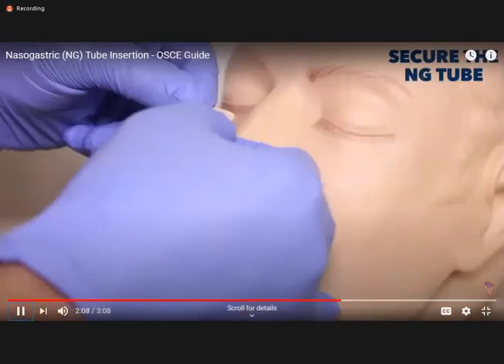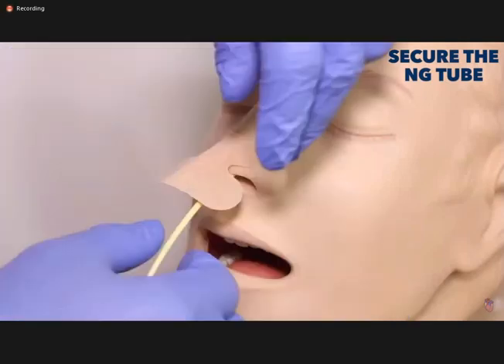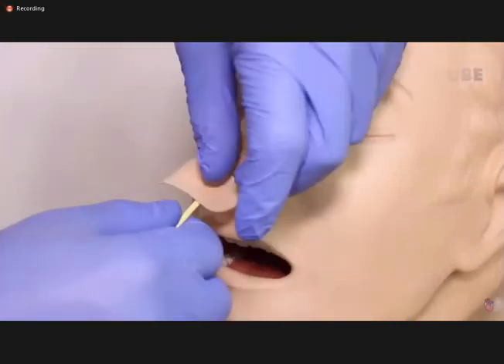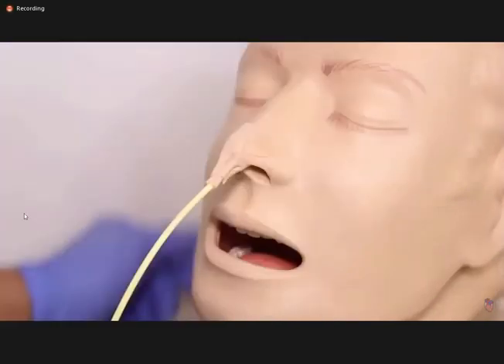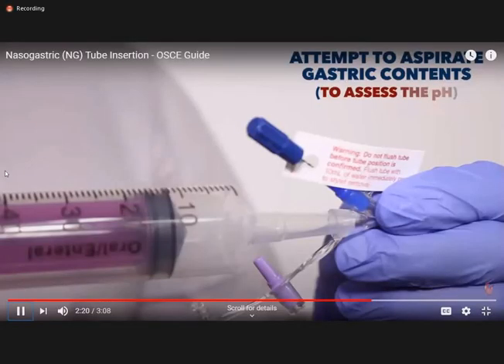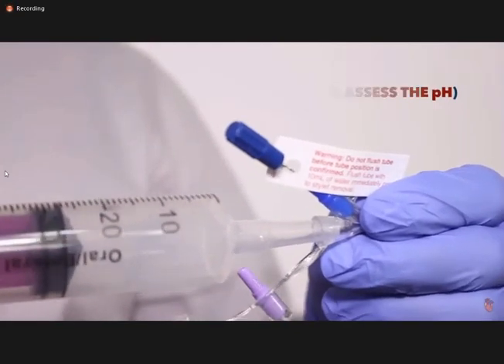Secure the NG tube. And how to secure? Like this, or with adhesive tape. And this is a syringe to assess the gastric contents.